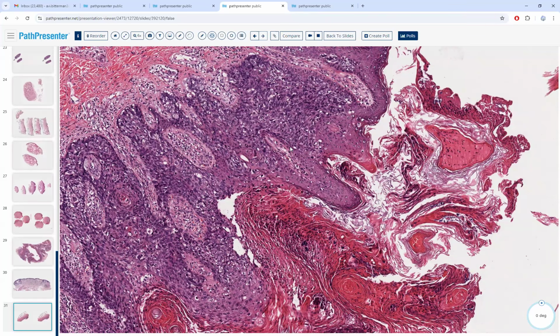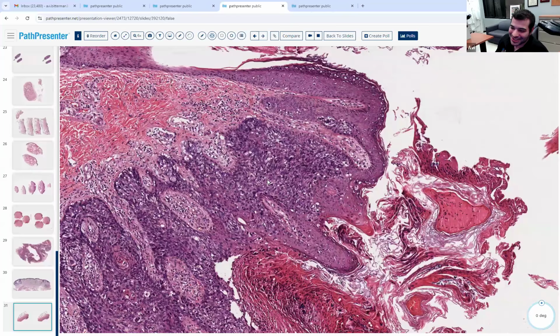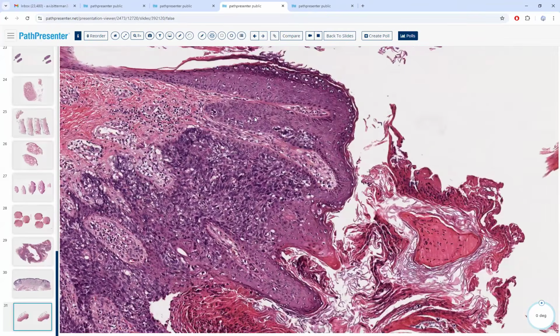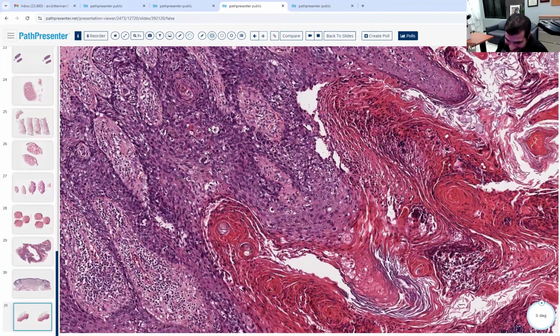Okay, like CK7, CK20 if you're worried about Paget's. Extramammary Paget's, S100, Melan-A. Let's keep it organized. CK7, CK20. All right. If we're thinking just to rule out a melanoma, let's do what? S100. Yes. HMB45, Melan-A. You know your melanoma markers. Okay, so you mentioned your keratin stains for a squamous cell carcinoma.